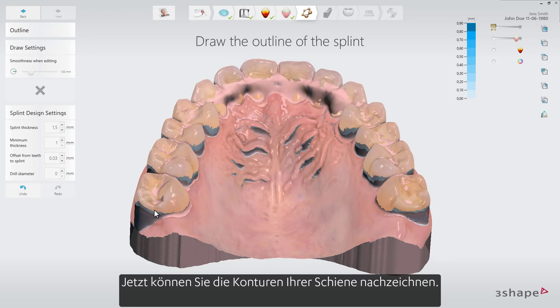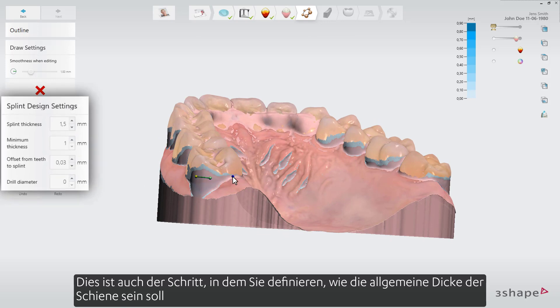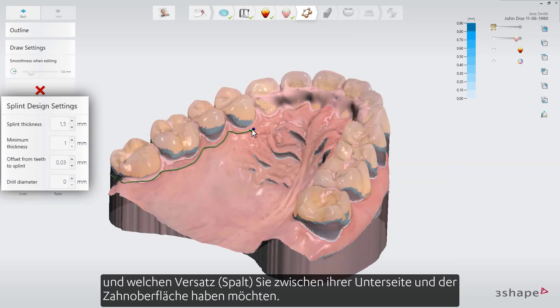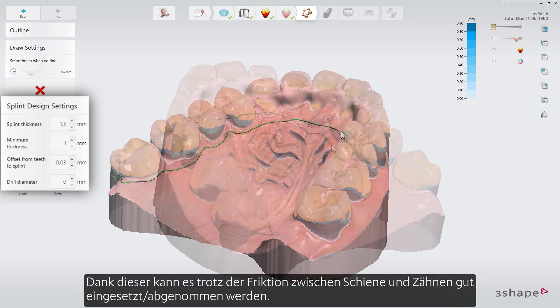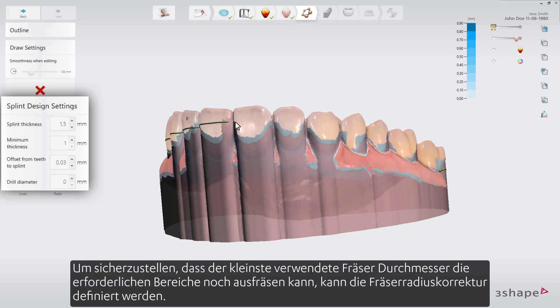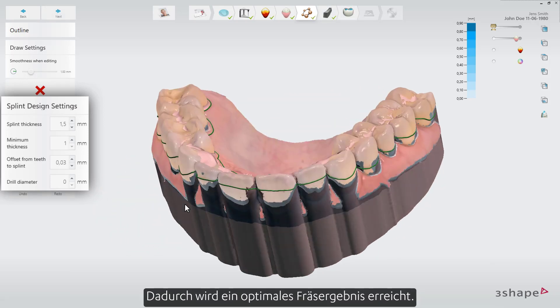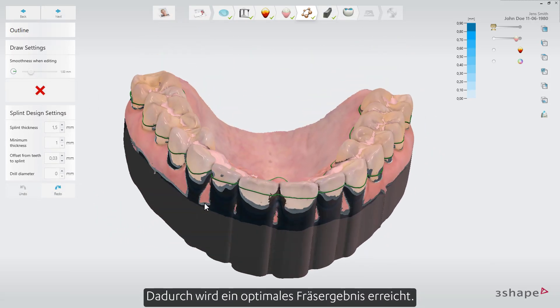Now you are ready to trace the outline of your splint. This is also the step where you define how the general thickness of the splint should be and which offset you want to have between its underside and the tooth surface. Thanks to this, it will be able to slip on and off in spite of the friction between the splint and the teeth. In order to make sure that a given drill size can still mill out the necessary areas, the drill compensation value can be defined. This will allow the splint to be seated correctly.